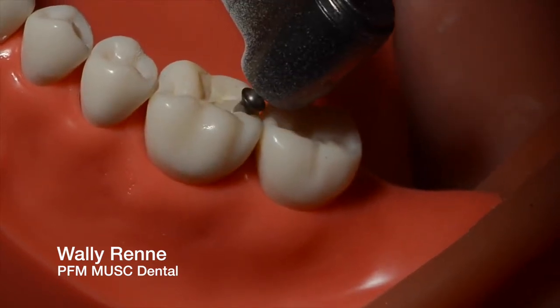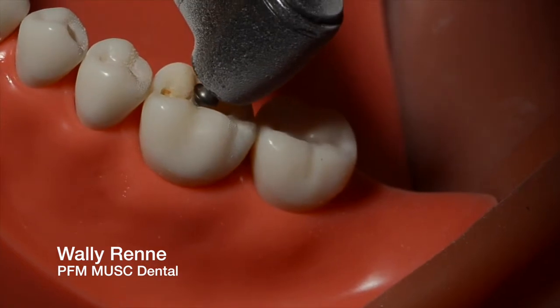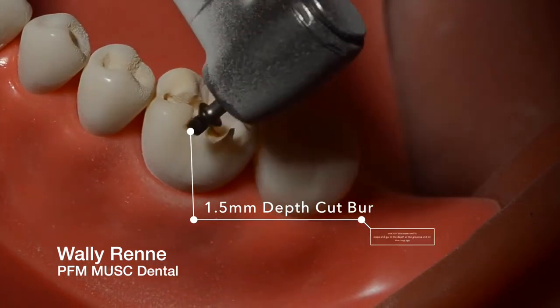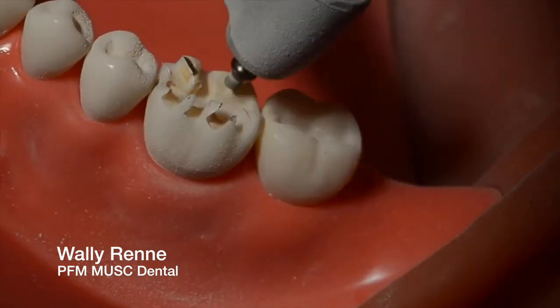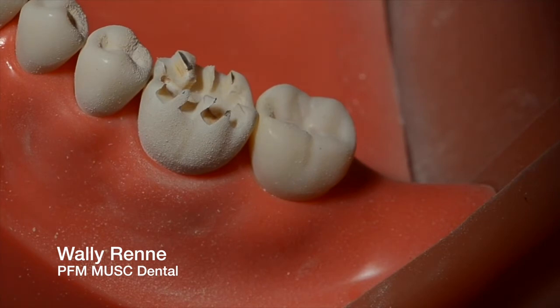Start off with some depth cuts using the Meisinger 1.5mm depth cut bur. Sink it in the central groove all the way down and it will bottom out, then go through your buccal and buccal grooves. Go right through and then through the cusp tips. Same thing on lingual — through the cusp tip, through the lingual groove, and then back through the transverse ridge. You want about four or five on each side and then through the central groove.